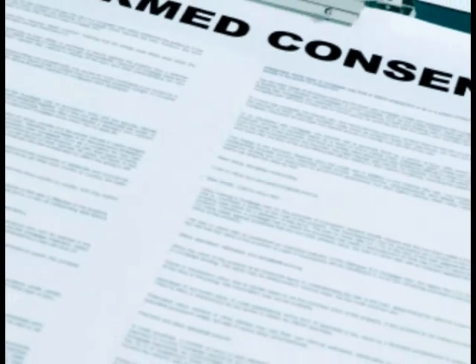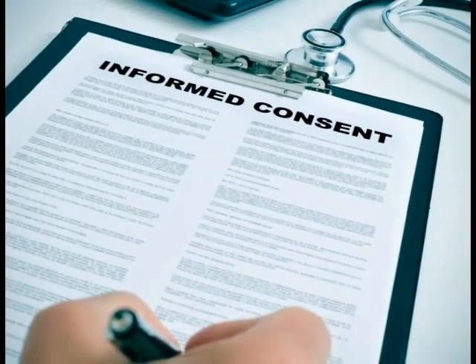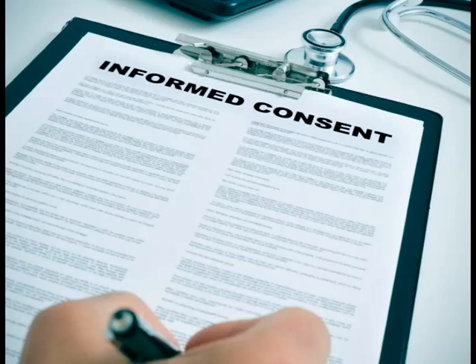Patient preparation: It is important to always inform the patient of the details of the procedure and to obtain informed consent. Once the patient has agreed, place the patient in a supine position with the knee extended.